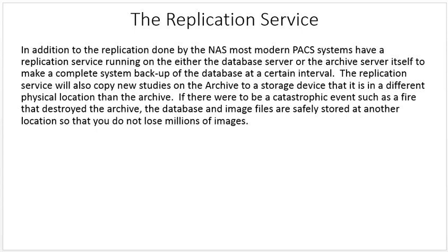Then, say on Sunday, you'll run a full, and that will back up everything that's in there. Right? And once a full backup is downloaded and it's safe, it will delete the old backup that happened a week before. So you'll have one day a week, you'll probably run a full backup, and every other day of the week, 6 days a week, you'll run an incremental. Just one possible way that a system might be backed up. It's not the standard way, it's not the way everybody does it, it's the way I would do it.